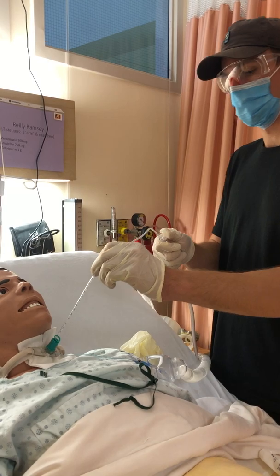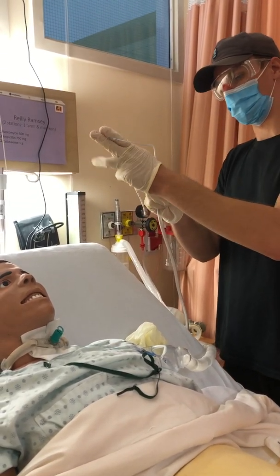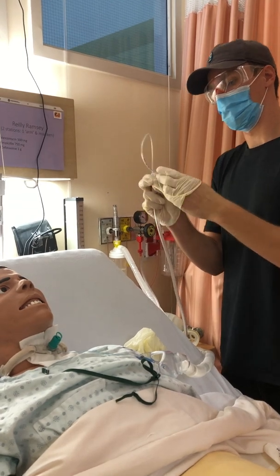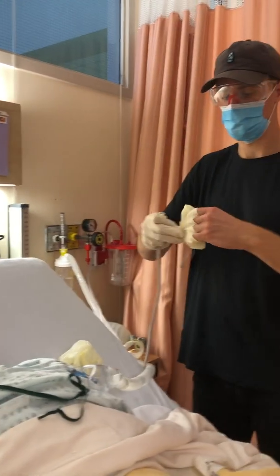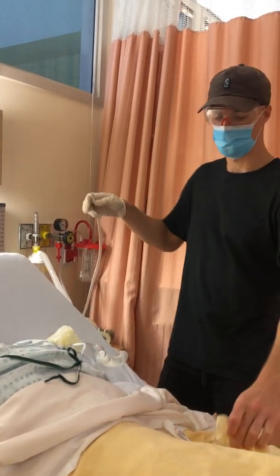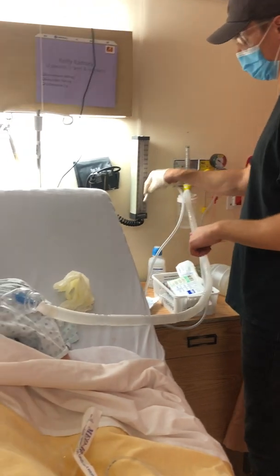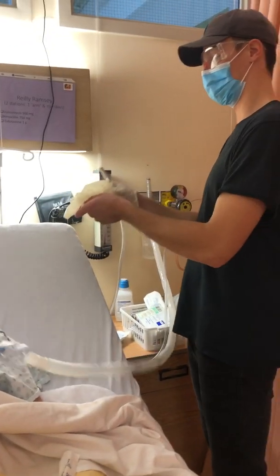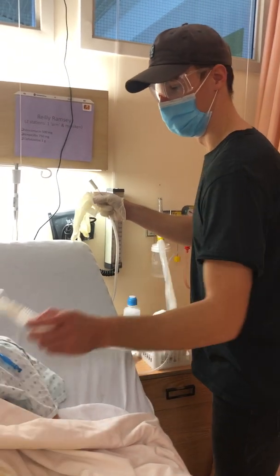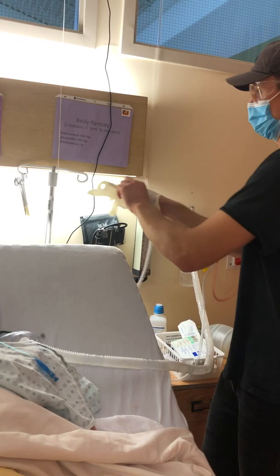That's done. I'd remove it, and then I would wrap my glove around this, take this off, and chuck it in the garbage here. Then I would suction out all the sputum in some sterile water just for a little bit, and then I'd wrap this up again in a clean glove and put it back.